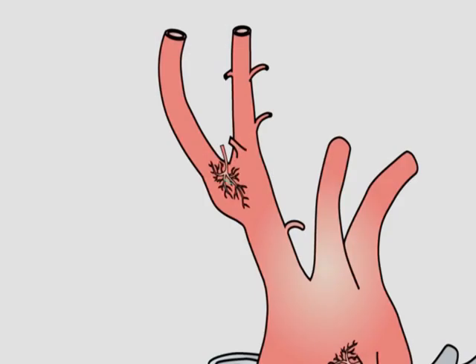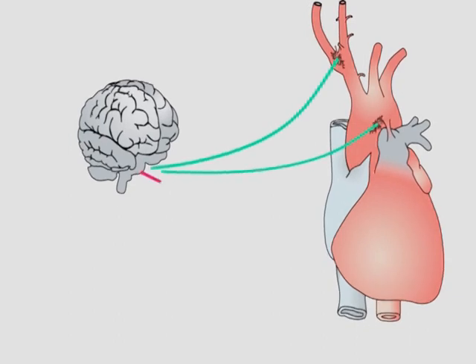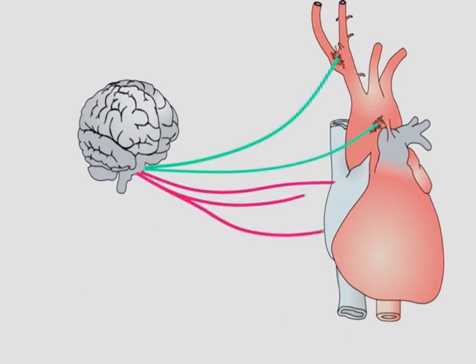When the rat is tilted up, the blood pools in the lower leg area due to the effect of gravity, and the pressure decreases in the head region. The decrease in pressure is detected by the baroreceptors located in the carotid artery and aortic arch. They communicate these changes to the brain and bring about a reflex increase in heart rate and blood pressure via the sympathetic nervous system to ensure adequate blood flow to the brain.